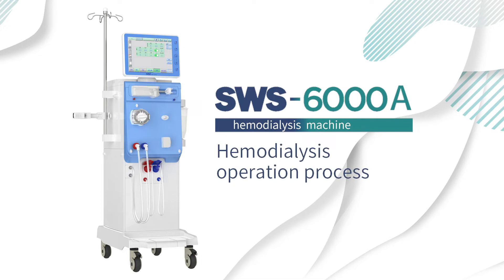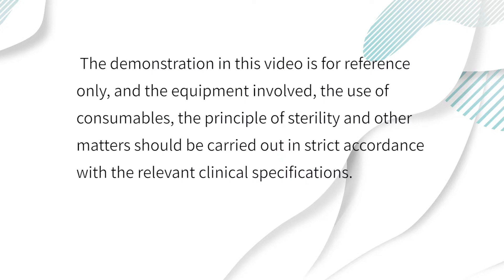SWS 6000A haemodialysis machine operation process. The demonstration in this video is for reference only, and the equipment involved, the use of consumables, the principle of sterility, and other matters should be carried out in strict accordance with the relevant clinical specifications.